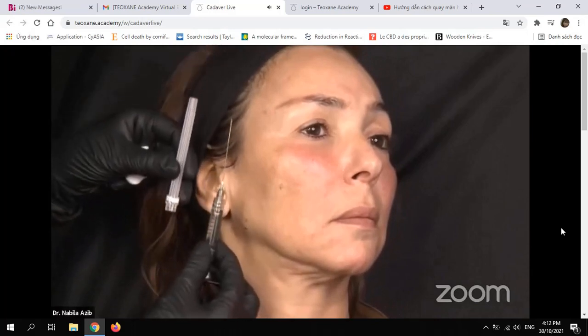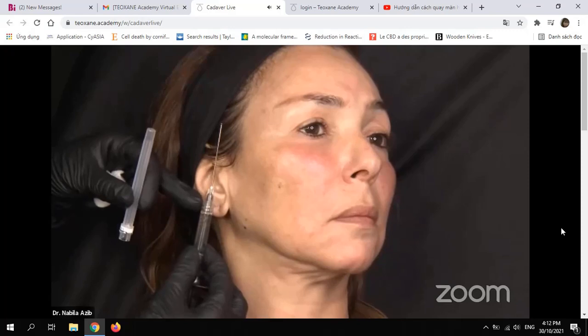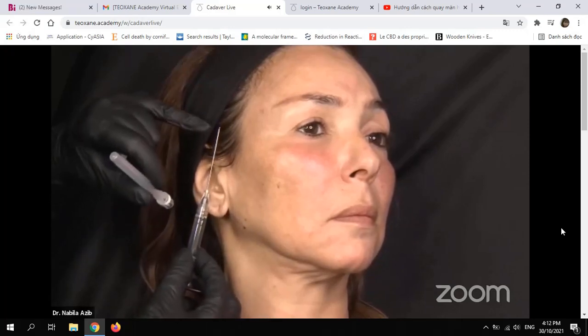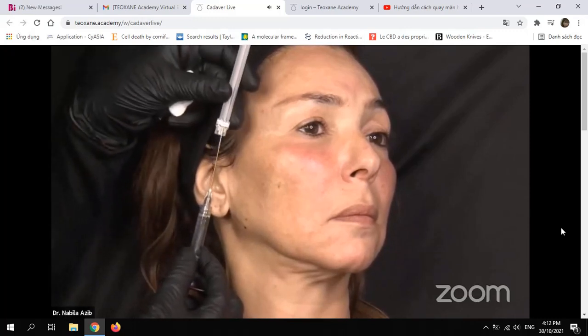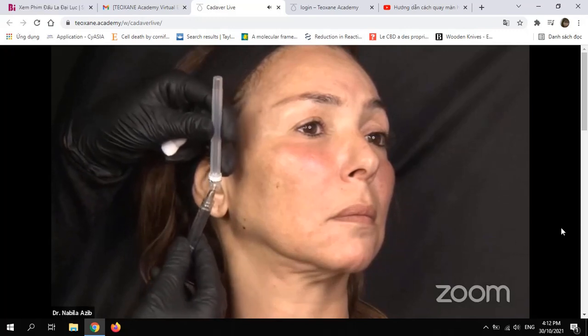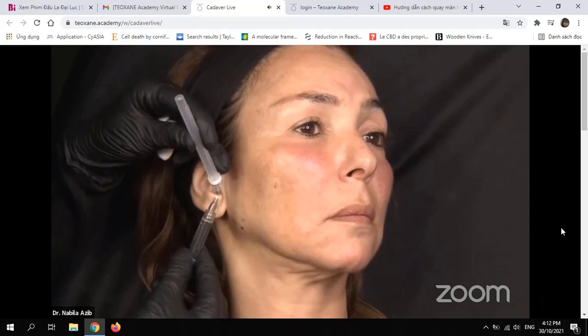And here it's a 50 millimeter length. This is a 22 Steriglide cannula, and you see this black marking shows that the bevel is up here. So what I do is what I call the straw technique. I'm using the tip of the cannula to bend my cannula.